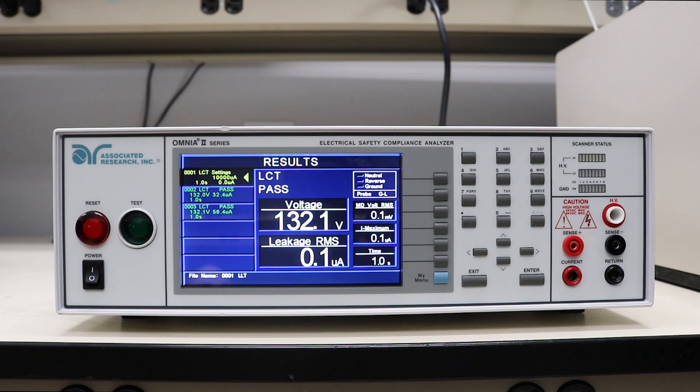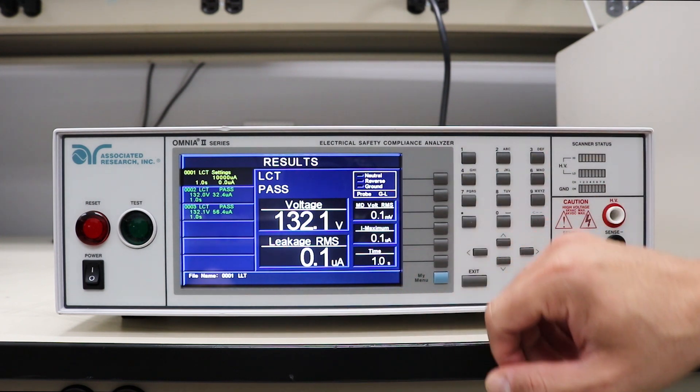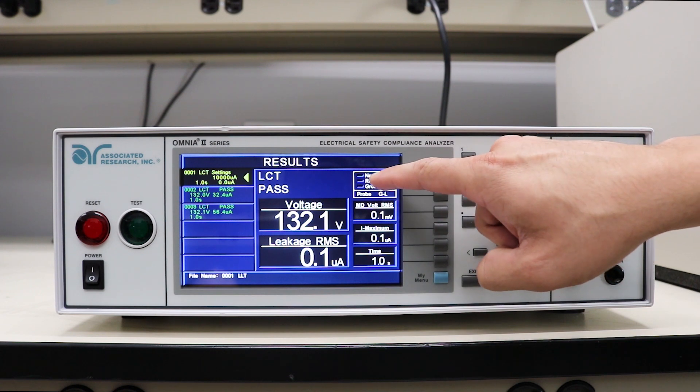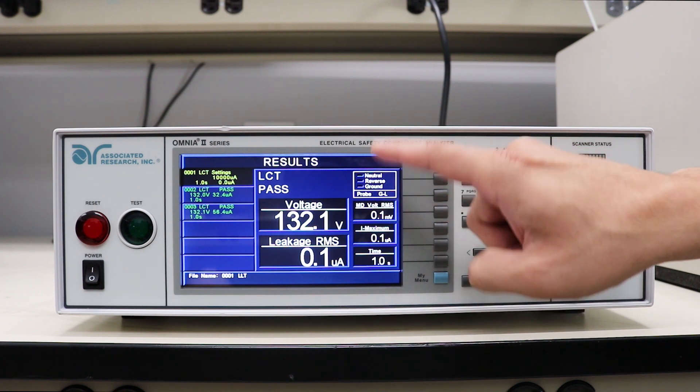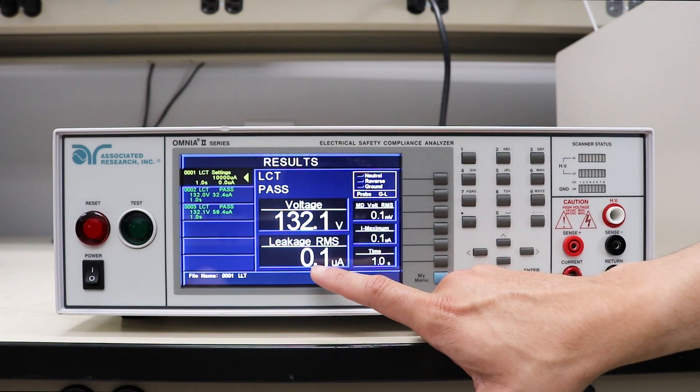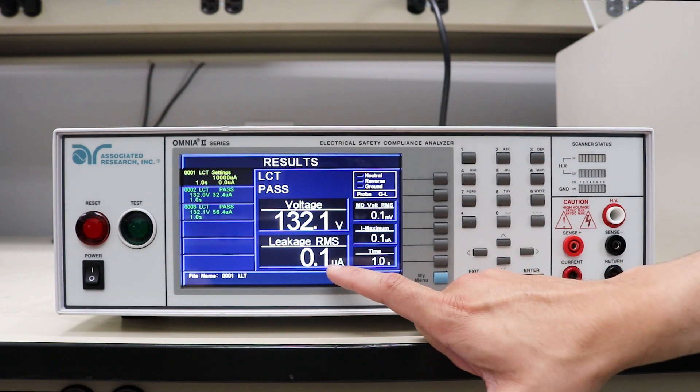Let's take a look at the test results from our three earth leakage test steps that we just executed. This is the first test step where 132 volts were applied. As you can see, for the fault conditions everything was normal and the recorded leakage current was negligible, very close to 0.1 microamps.